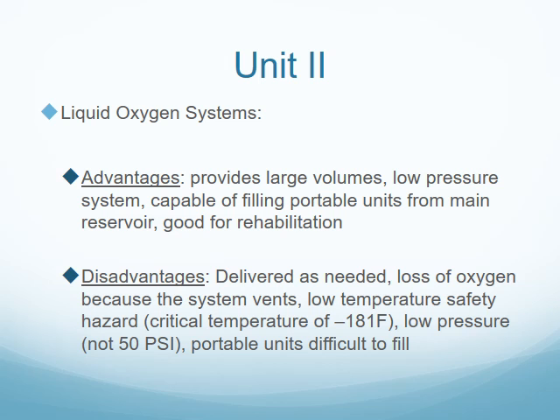Next, I'm going to talk about the advantages and disadvantages of using a liquid oxygen system, outside of the fact that it's very expensive. Some advantages: it provides large volumes and is a low pressure system capable of filling portable units from a main reservoir, and is good for rehabilitation. Like I was saying before, my job at the SNF was to go out every morning and fill up these little portable units for the patients and residents to use. So it's very useful for that reason, because liquid oxygen systems can hold a lot of O2, and that's great for a facility that does not have piped in oxygen.